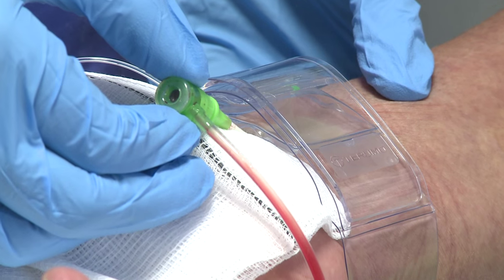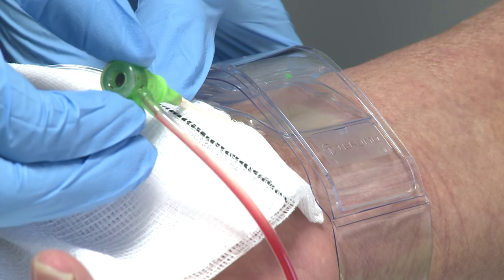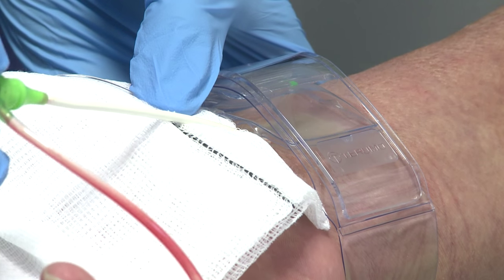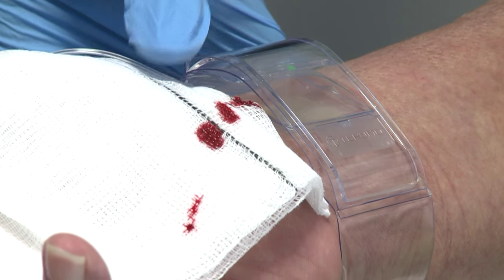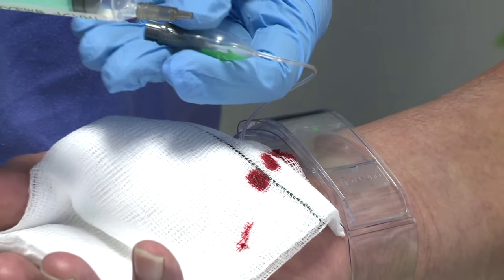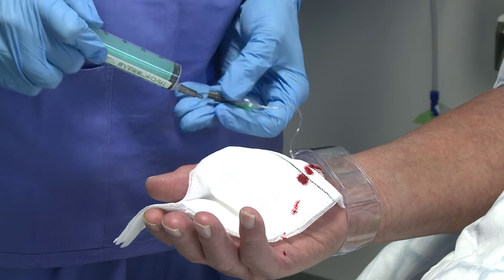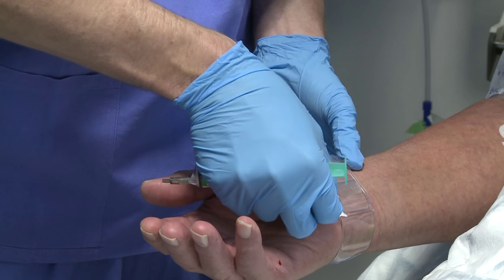You might just feel some discomfort there. If there's any pressure we would want to stop and consider other measures, but here this is coming out very freely. We see that we haven't quite achieved haemostasis so we'll just inflate the cuff — we have another 3 mils we can inflate by. So at this point we're at the maximum inflation size of 18 mils and we've achieved haemostasis.